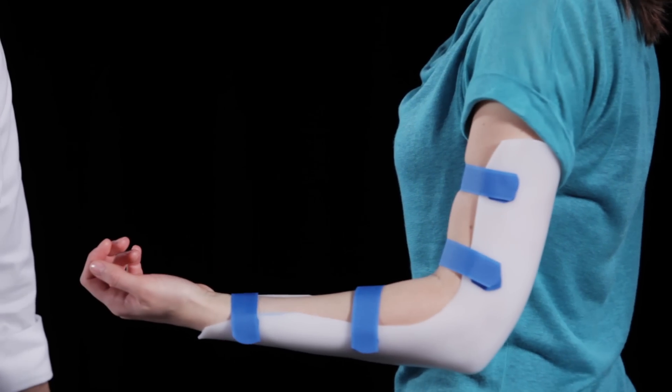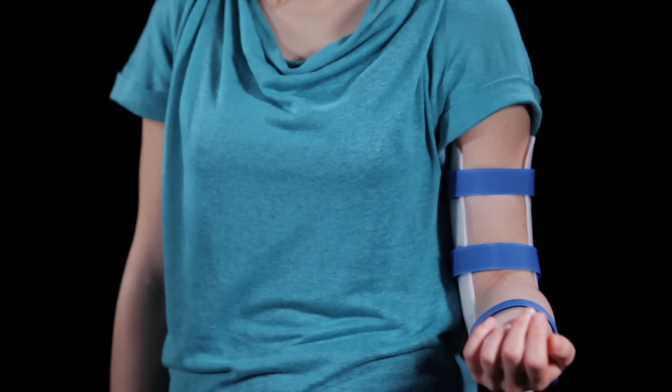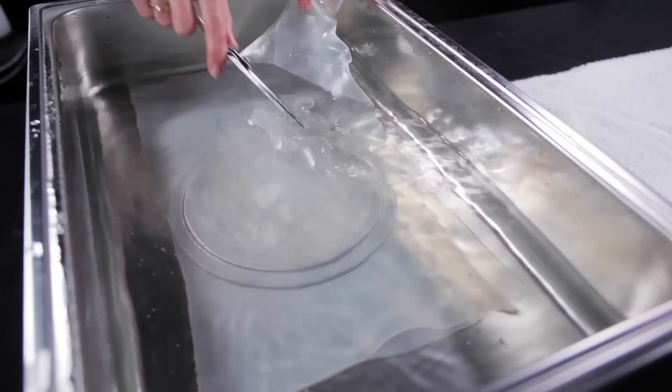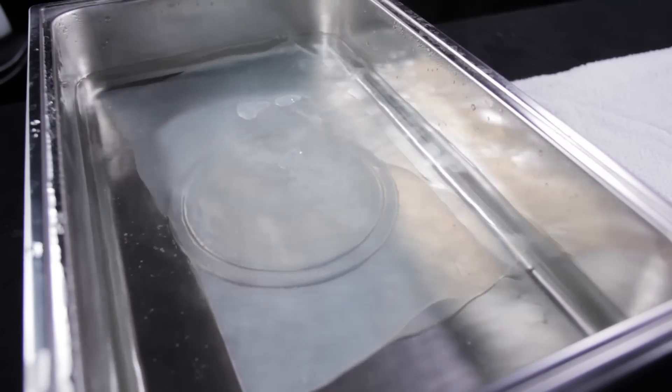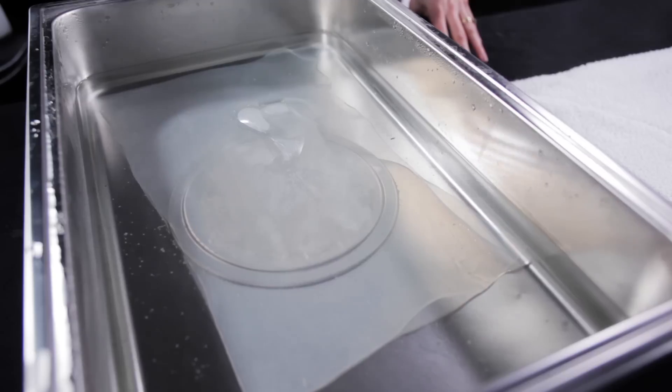Trim all straps to fit. Make sure the patient is comfortable. Orfit Natural NS has perfect memory. This entire orthosis can be completely remade by putting it back in the hot water bath. Within minutes it completely reverts to its original size and shape.